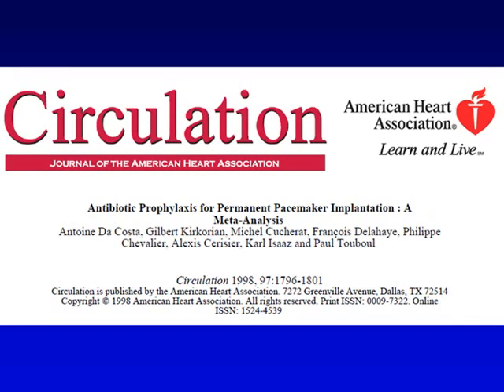Antibiotic prophylaxis for permanent pacemaker implantation, a meta-analysis has been made, and this goes back to the 1980s. For a long time it's been considered a good idea. Nevertheless, there were some old-time implanters who said, "Well, my risk of infection is so low, there's no point in giving antibiotics." And then you have that same issue that you had with dental prophylaxis, which is it adds cost, it adds the possibility of anaphylactic reactions, it adds to the risk of resistant organisms.